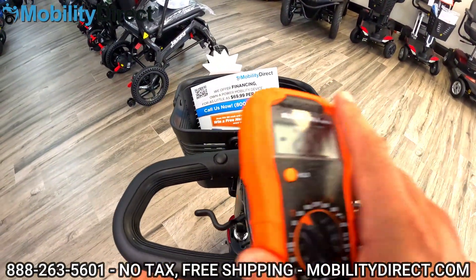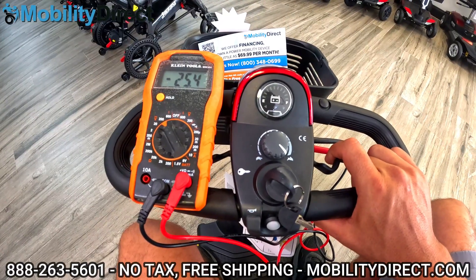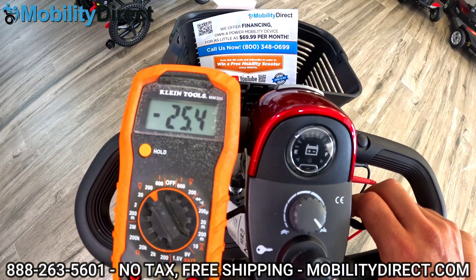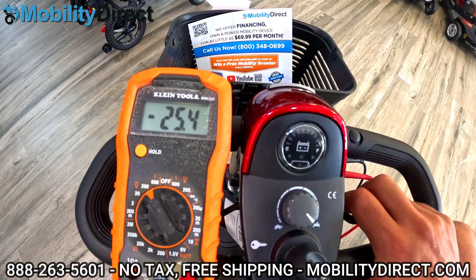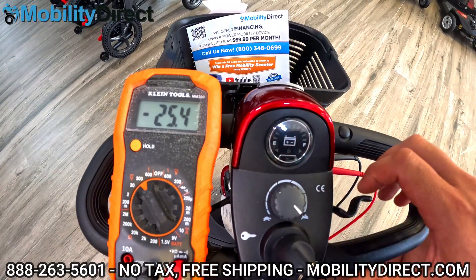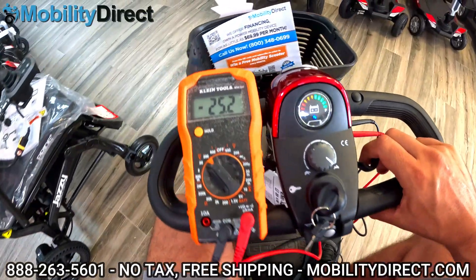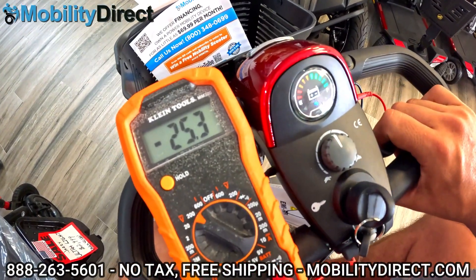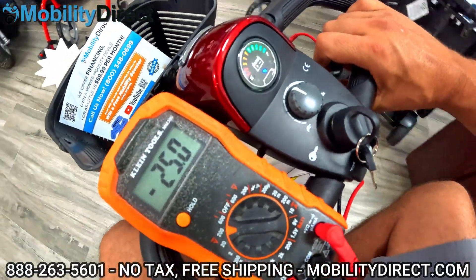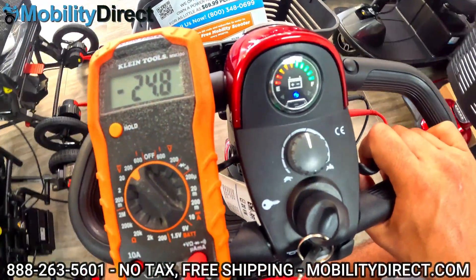So here we go — I've got the voltage meter and I'm going to start moving the scooter. You want to be seated on the scooter; it needs to have weight on it. Preferably on a flat surface. As you start to go, monitor how far the voltage is dropping — it should not drop below 24 volts. It might do it for a second as you're starting, but once you're on a smooth roll and moving, it should stay above 24 volts. We're at 25.4 at standstill, and as we're going, we're at 24.8. The fact that it's not dropping below 24 volts tells me these batteries are in great shape.